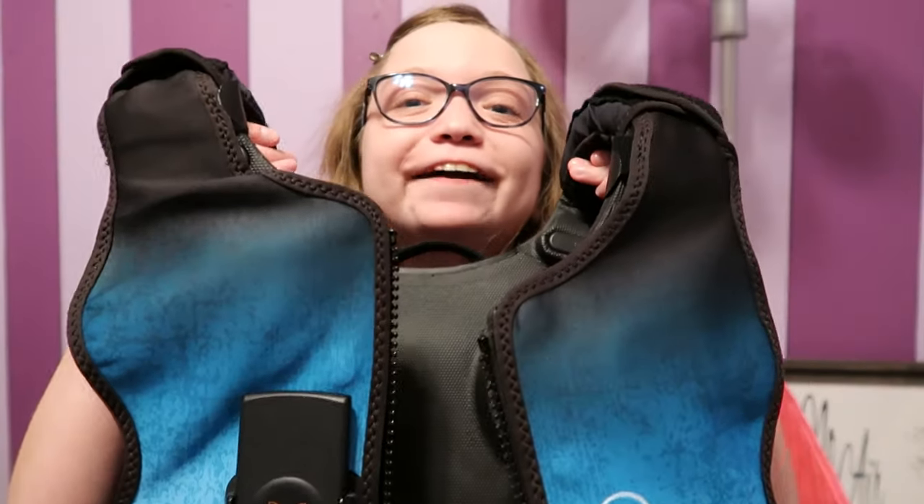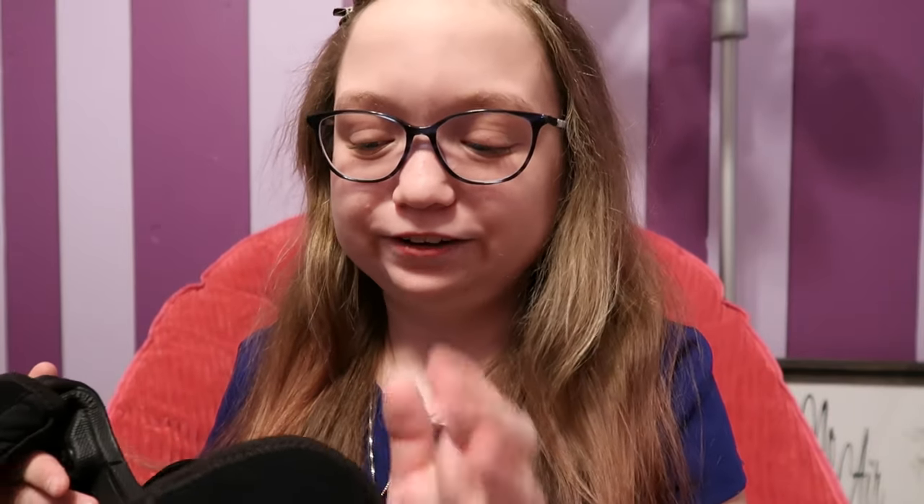The exciting thing is I got my Monarch! I am so excited and so happy. If you don't know what this is, this is a cordless tubeless vest.